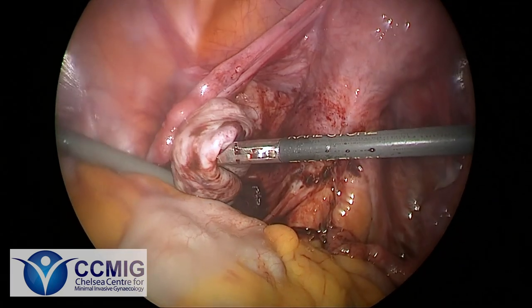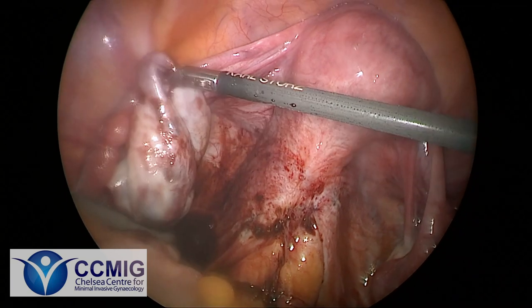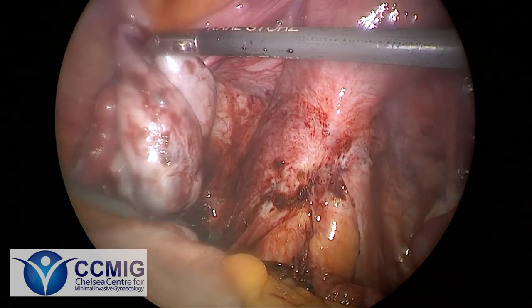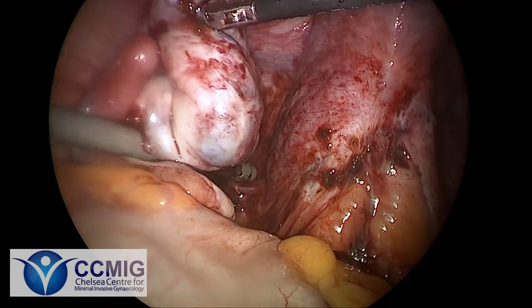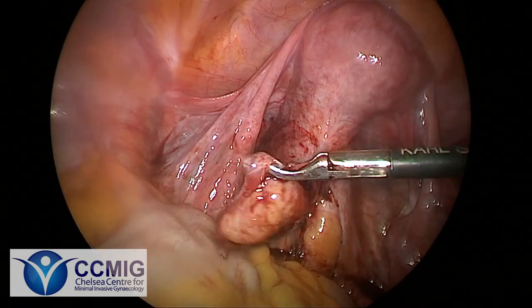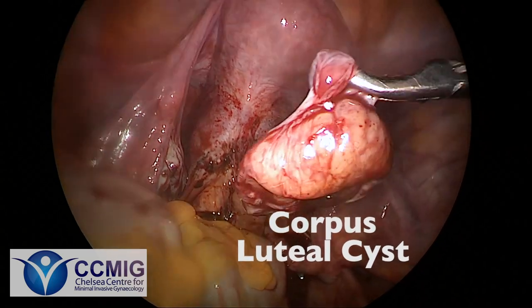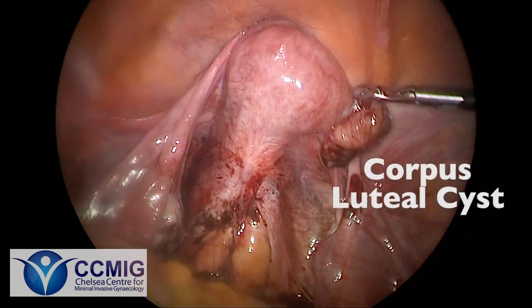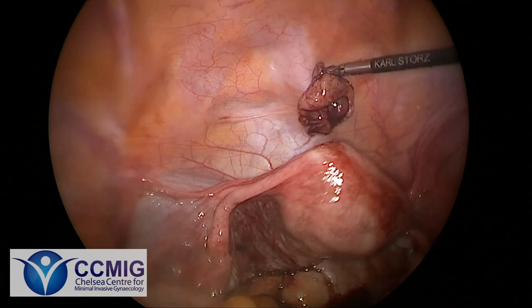The normal white tissue around the edge of the endometriotic cyst remains healthy ovarian tissue, which will go on to produce follicles and release eggs. There is however some collateral damage, and any surgery on the ovary can potentially impact on the ovary's future function. This risk must be balanced with the effect that endometriomas themselves have on fertility and with the improvement of symptoms we see after excision.